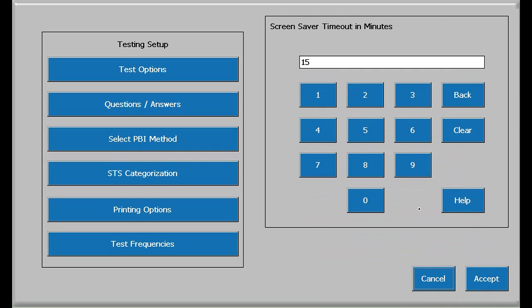The screen saver timeout option sets the delay before the test screen is covered. Enter the time in minutes. If zero is entered, the screen saver will not function, except to close out the window.